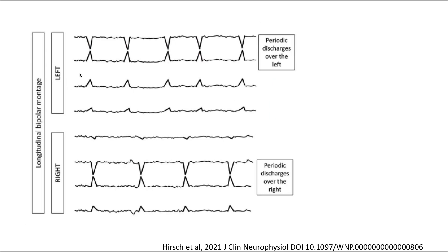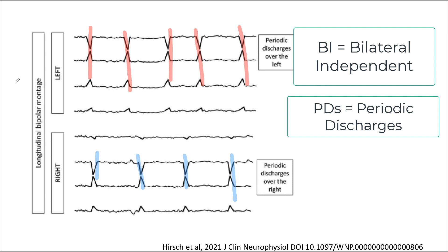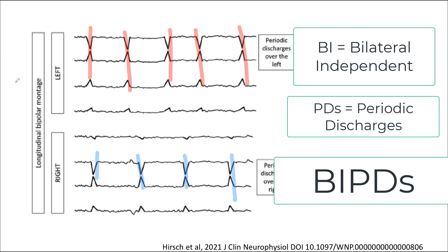Here we see periodic discharges in the left hemisphere occurring at a predictable interval, but also discharges in the right hemisphere that appear to have no relationship to those on the left. Here we use the term bilateral independent, abbreviated BI. Because they are periodic discharges, we call these bilaterally independent periodic discharges, or BIPDs.